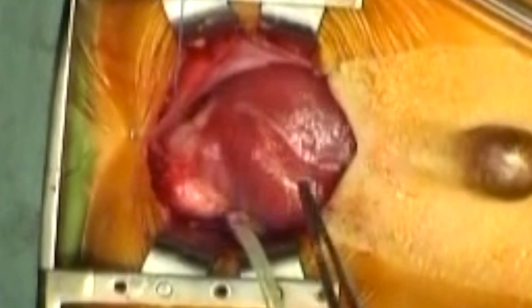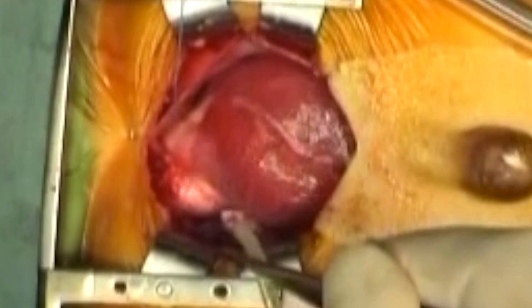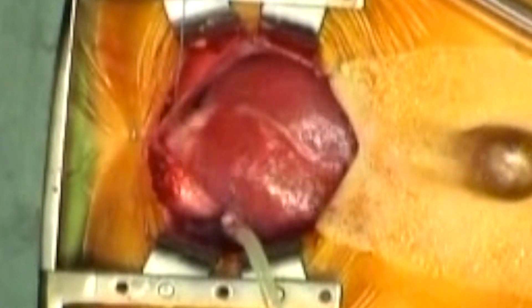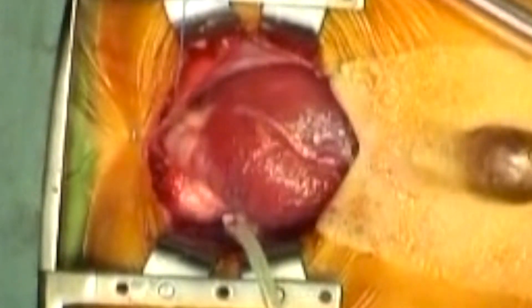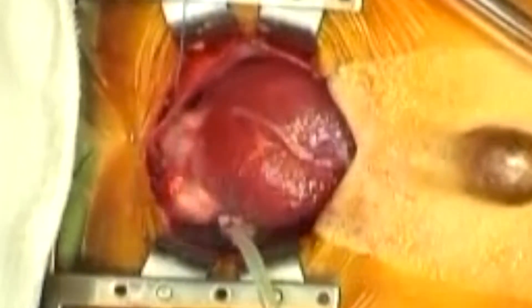We pause here briefly to note the left anterior descending artery, then we note the course of the left ventricular diverticulum. The left anterior descending artery sits on top of the interventricular septum. Above it in the picture is therefore the patient's left ventricle, and extending to the right of the picture towards the patient's feet, just under the skin, is the left ventricular diverticulum.